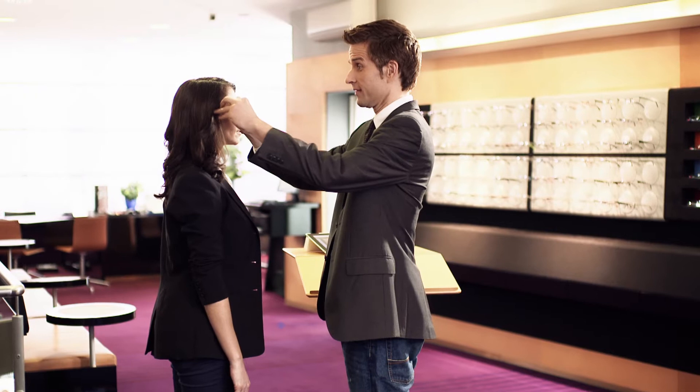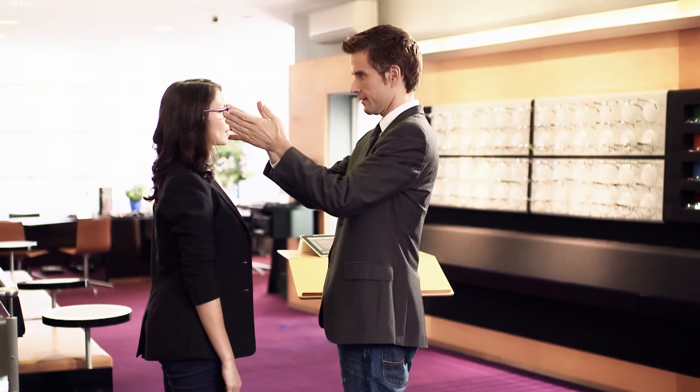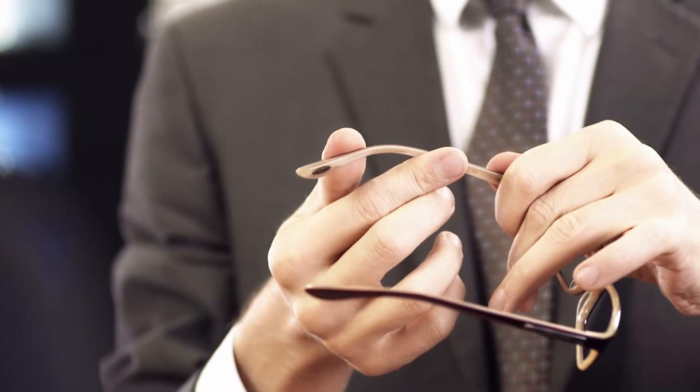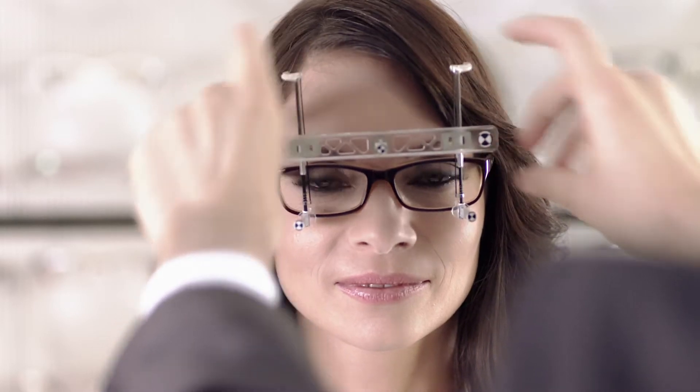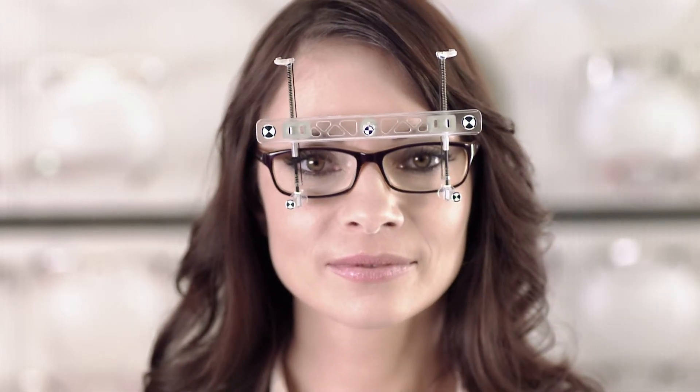First of all, adjust the selected frame correctly to your patient. Then start the measurement procedure. Place the measurement tool with both hands on the frame. Press the spring struts down and apply the four hooks around the frame edge.